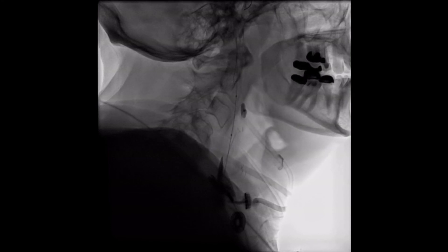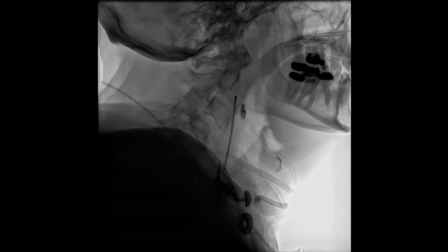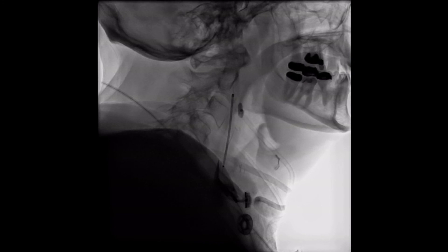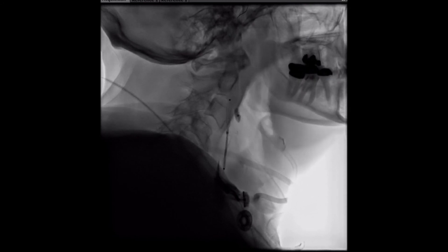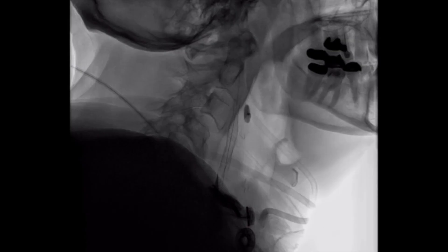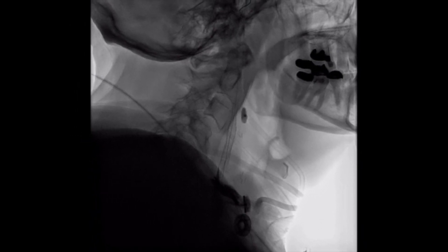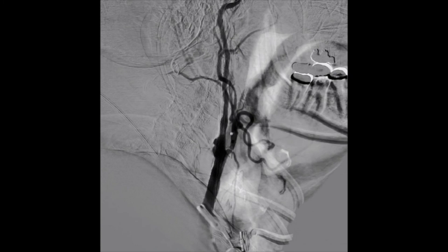Angioplasty is performed and a stent is navigated through the occlusion and deployed. After the stent is deployed and while still under flow arrest, through the MoMA catheter we aspirate 10 to 15 cc's of blood and look in it for debris. Once we see no debris, we deflate the balloons with the external first and the common second, to prevent any debris from going intracranial once flow is reestablished. Final control angiography demonstrates patency of the stent and reestablishment of flow into the distal internal carotid artery.